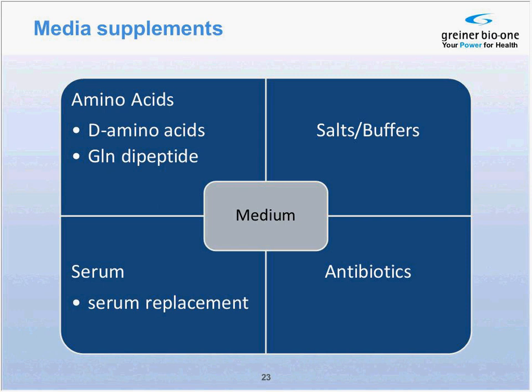However, this is not recommended because it might mask any contaminations that appear. Therefore, antibiotics should only be used in an acute phase of a contamination, or when cells are isolated and cultured for the first 2 or 3 weeks.